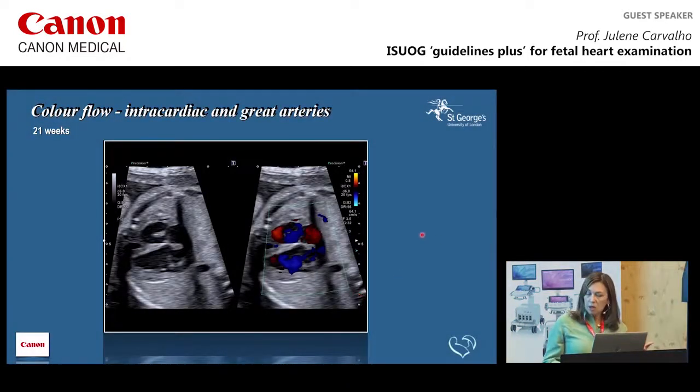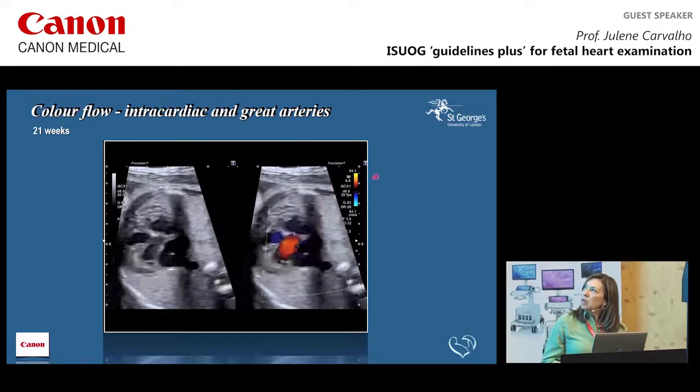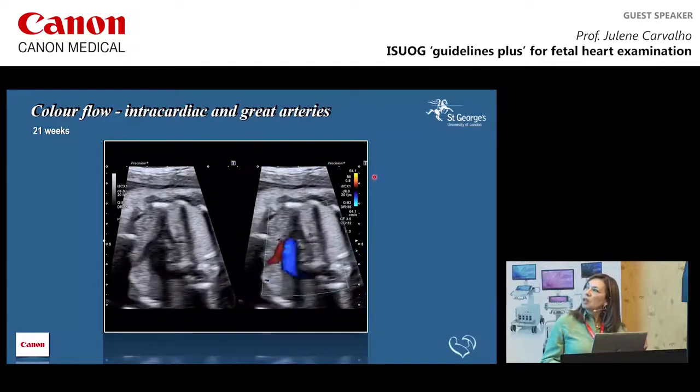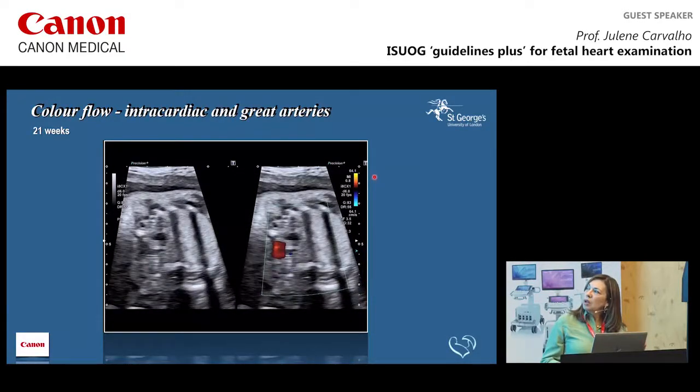Color really is fundamental if you're doing a fetal echo, because it gives you a lot of information. You improve visualization of the structures, because the color contrasts with the myocardium, so it's easier, particularly if the patient is difficult to scan. You see here a nice shade of blue and red. If you're not used to color, red means towards the transducer, going up on the screen or towards where your hand is, and blue means going away from the transducer. Also note the scale here: the velocity is about 64 centimeters per second, which is a cardiac velocity, different from the obstetric velocity. And we can do a whole sweep through the fetal heart. Let's do it once again.